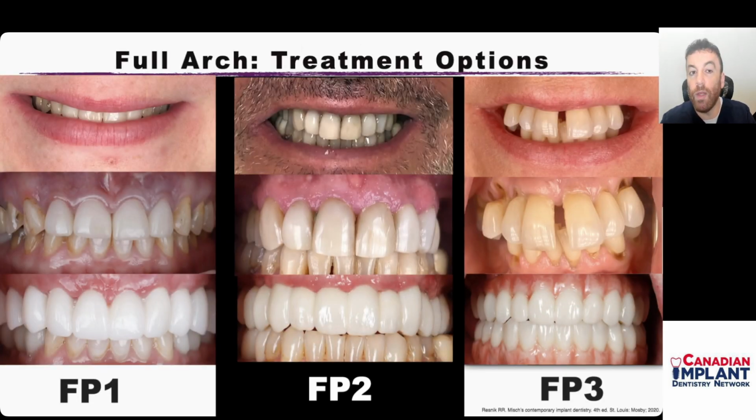How about full arch treatment options? What about if a patient comes in and they have a high smile line, or if they're a patient with periodontal disease? Would you treat these patients in the same manner if they came into your office? And the answer should be no. Unfortunately, sometimes these get boxed into the same cookie cutter approach in which bone reduction is performed and what we call an FP3 prosthesis, which is a hybrid prosthesis involving replacing the gingival tissue and the crown portion, is performed. A lot of these cases which come in as cases involving decay may not necessarily need that bone reduction.